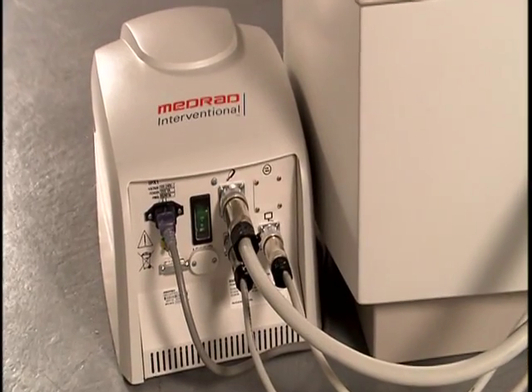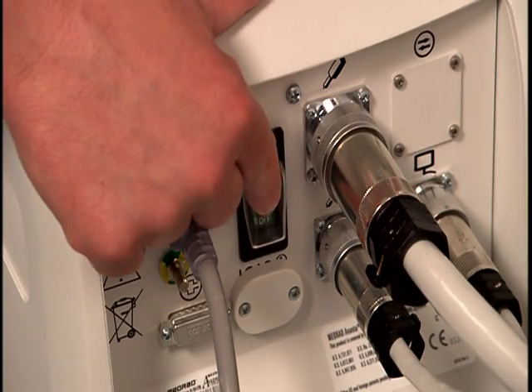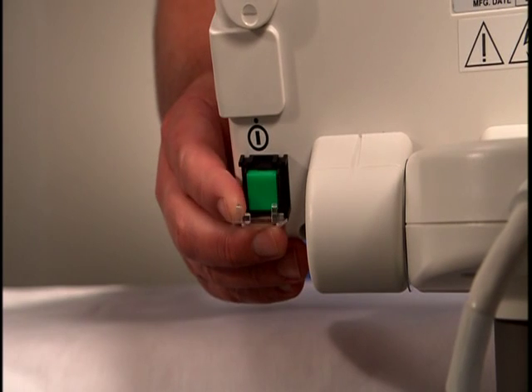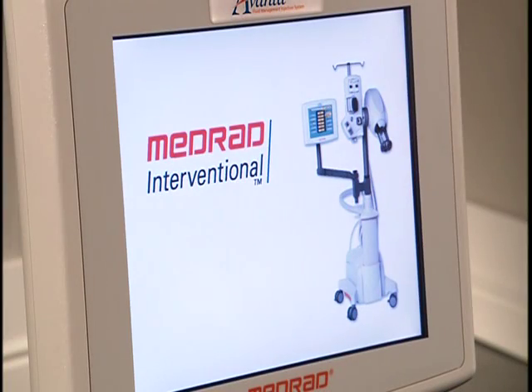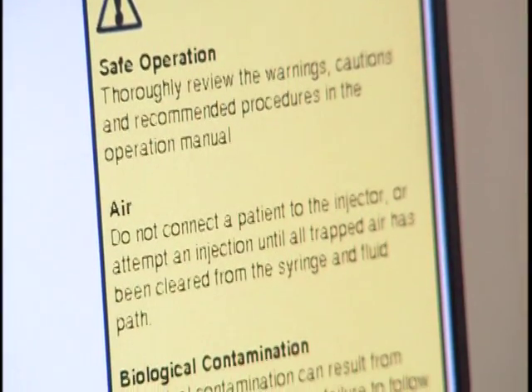To power on the Avanta fluid management injection system, first press the master power switch located on the power supply. Next, press the DCU power switch. The system will run a self-diagnostic check. A safety screen with information about current software version and safe operation appears on the DCU.